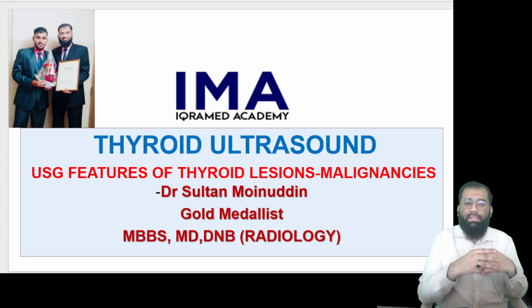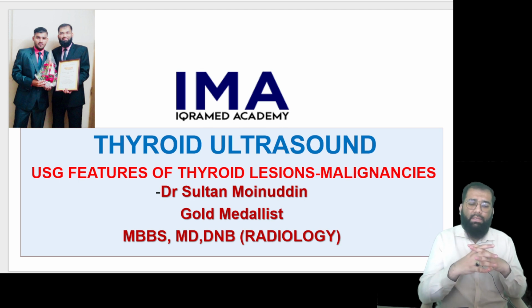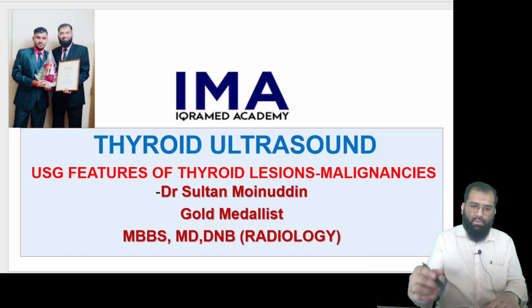Okay. The next important thing is that I have also discussed in part 1 the fundamental changes in the imaging features, and in brief the pathogenesis. In this lecture, I will be talking elaborately on 2 important malignancies out of the 5 which I had told you. So let us start without any delay.